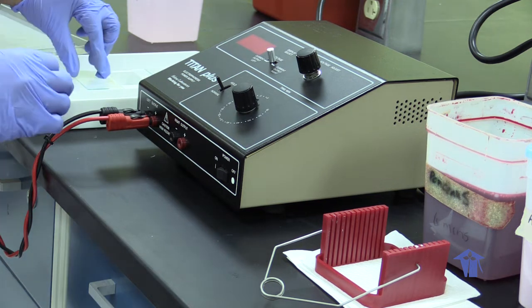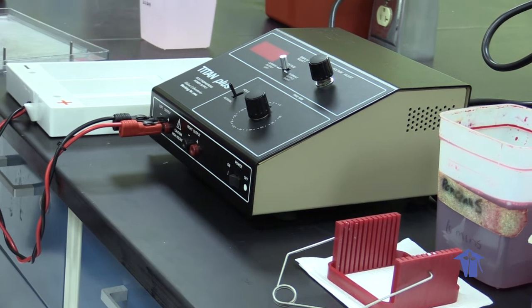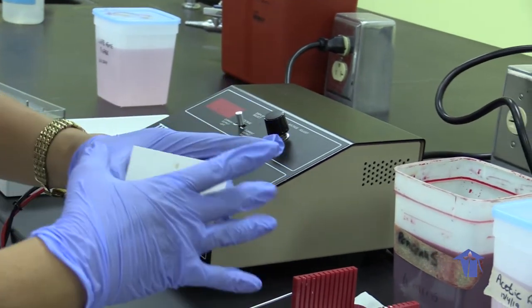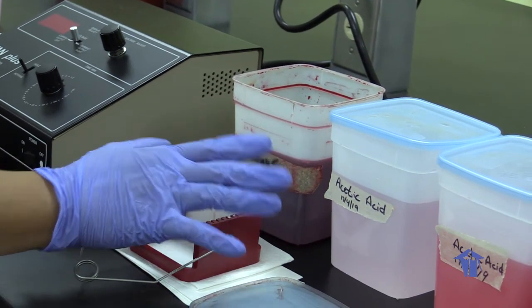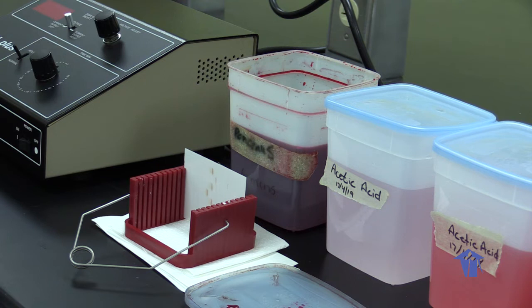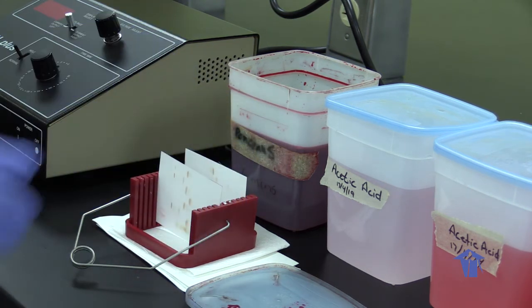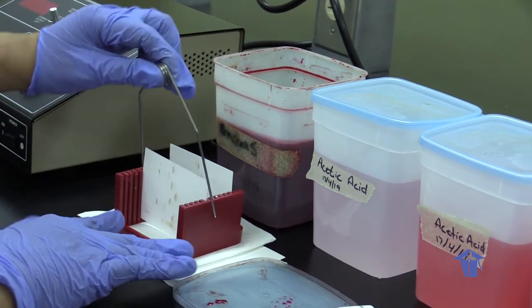I'm going to stain. The staining procedure has to go into Ponceau S for 6 minutes.